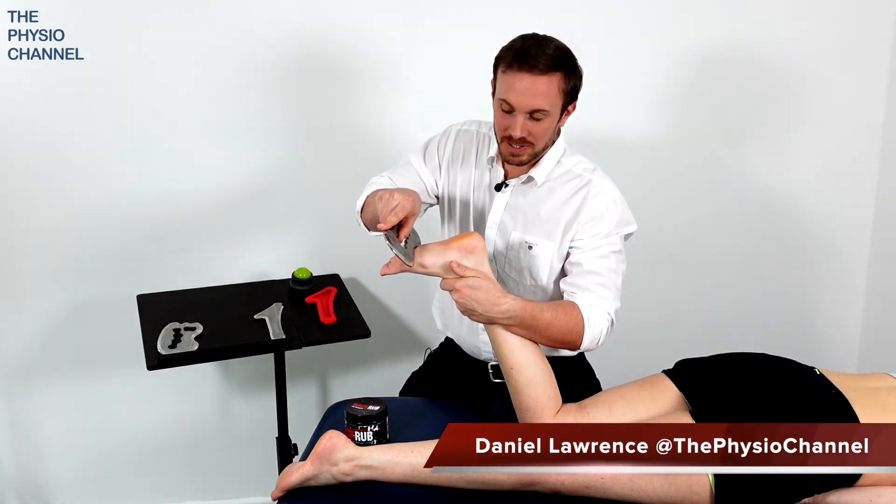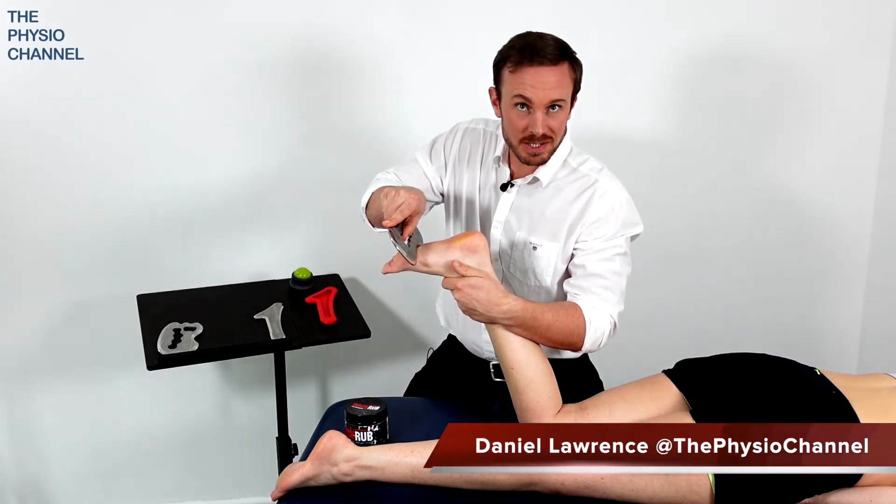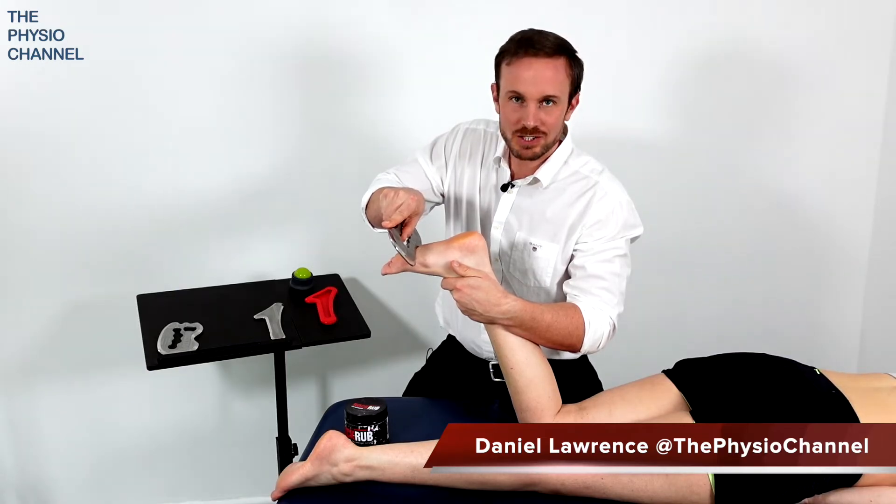Hello and welcome to the Physio channel. In this video we're going to look at how to do some instrument assisted soft tissue mobilization for the foot.